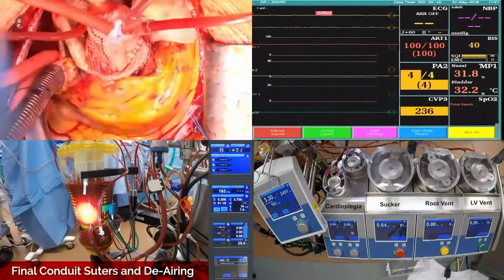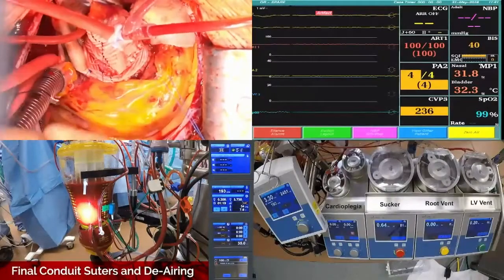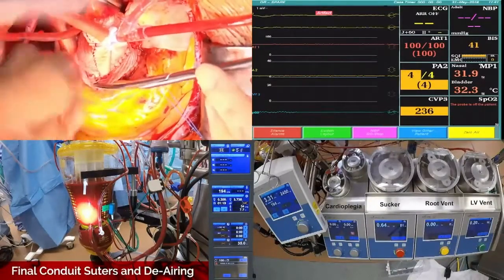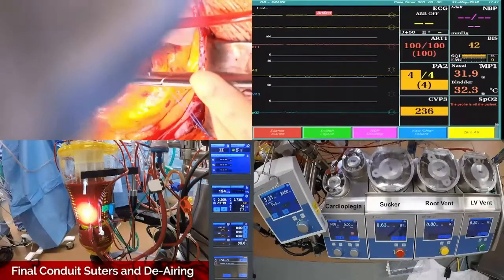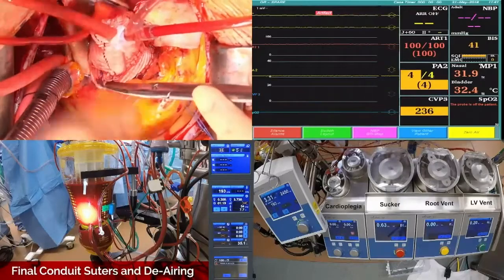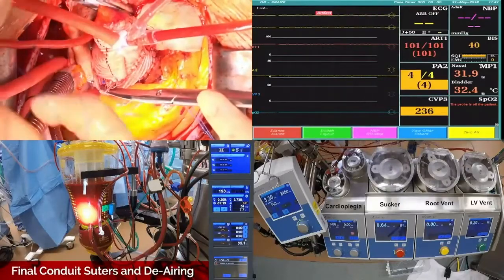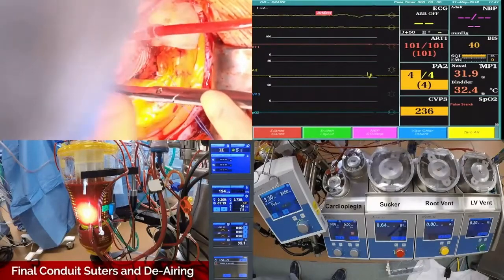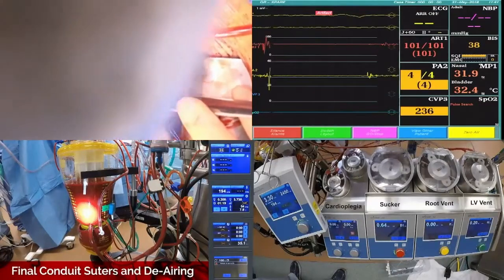Okay. So these are the final sutures. Looks like it's sped up. That's pretty fast. Yeah. That's just me, Patrick. Man, that's cool. Cooley speed, did you say? No. Let me tell you, Cooley speed does not look like that. Cooley speed is just not stopping. That's how he did it. He was so incredible.